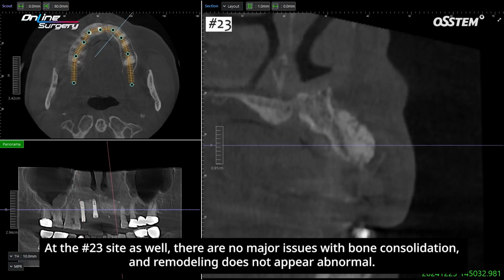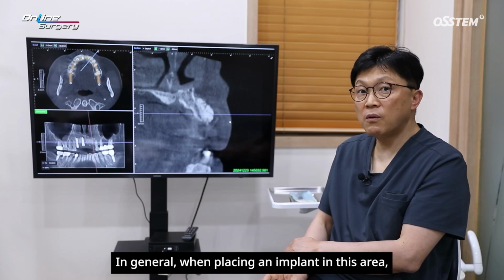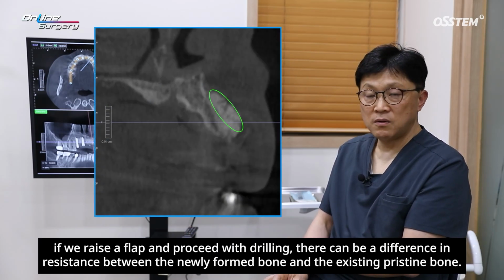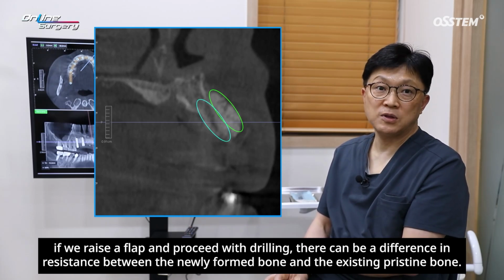At the number 23 site as well, there are no major issues with bone consolidation, and remodeling does not appear abnormal. In general, when placing an implant in this area, if we raise a flap and proceed with drilling, there can be a difference in resistance between the newly formed bone and the existing pristine bone.